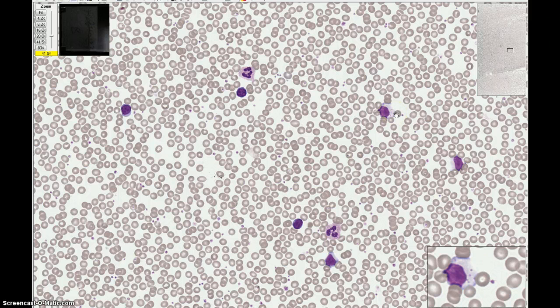Looking at this cell here, the nucleus looks like it's an oval shape, though the cell is compressed by the surrounding red cells a little bit. The chromatin in that nucleus looks a medium purple and it's quite homogeneous. On the right-hand side, you see just a few medium purple or azurophilic colored granules. Looking at the cytoplasm, it's a clear, transparent blue color. So this is a large lymphocyte.